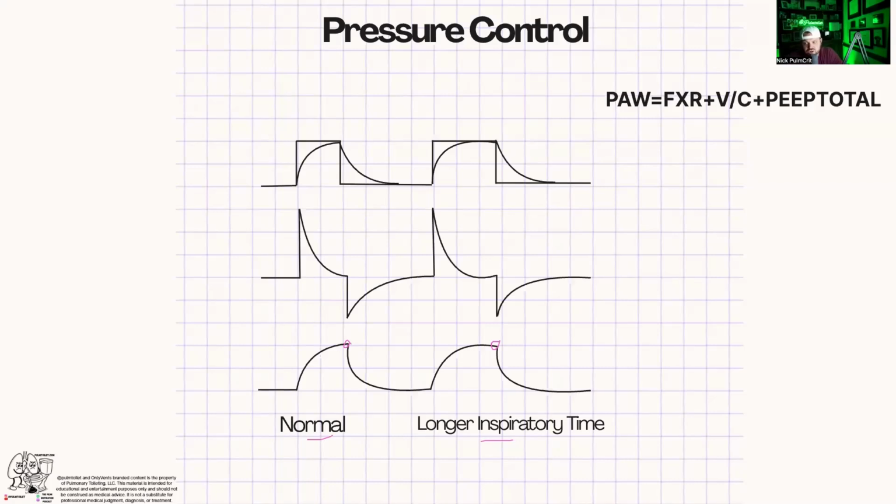Because there's no extra area under the curve, says JD from Canada, it looks like. That's true. Taking a step further, why is there no extra area under the curve, I guess? Flow went to zero. True. Not why did flow? You guys are dancing around it. For this example specifically, because volume can change sometimes. Inspiratory pressure is the same, so no further flow. Now pressure and alveolar pressure equal. Good. So you guys are all sort of like death by 1,000 cuts. I agree the flow is at zero and holding there.